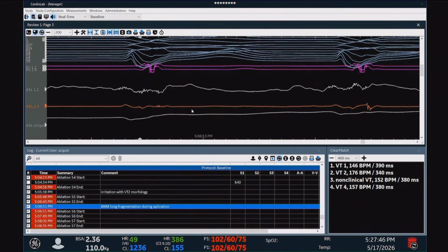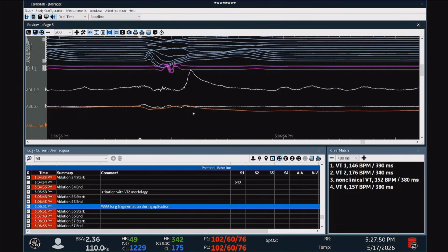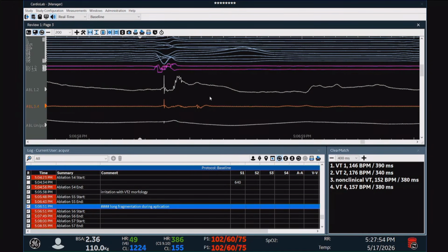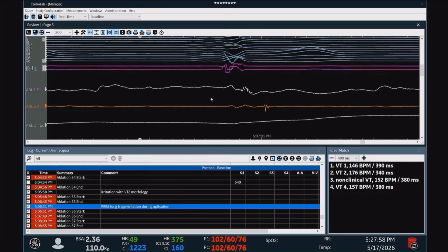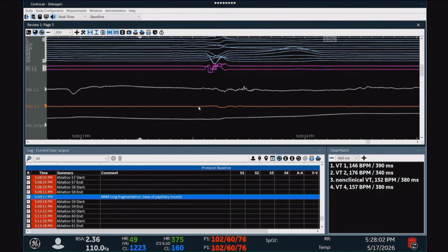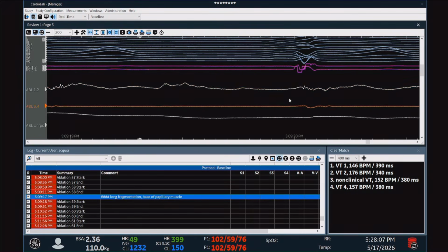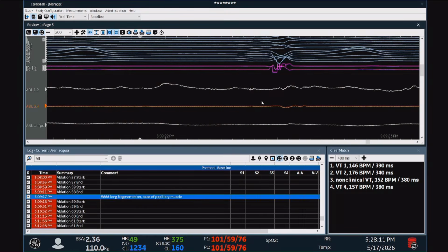They were in the proximal electrode, and then we pulled back the catheter and it went to the distal electrode, and this one disappeared. Next one: we moved the catheter, pulled back from proximal to distal, and then it started to disappear, and it's gone now. So you have an idea.